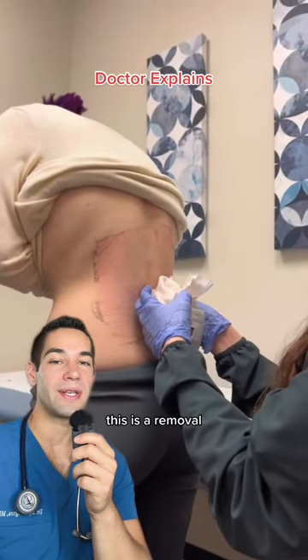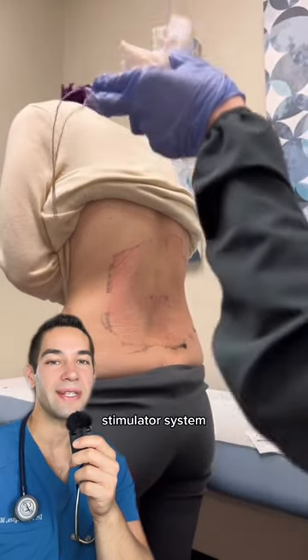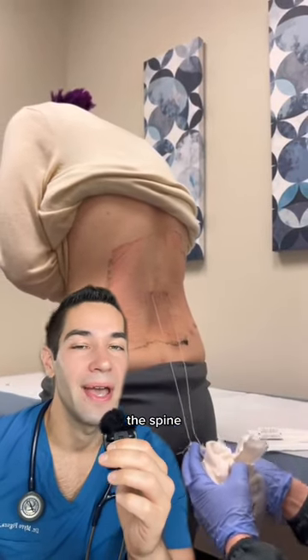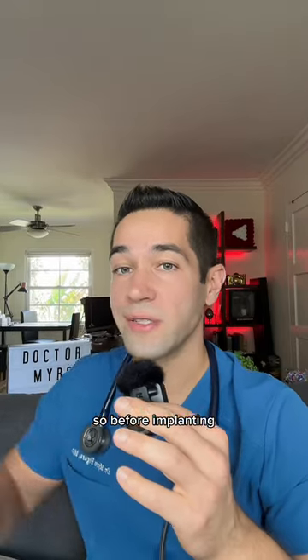This is a removal of temporary leads for a spinal cord stimulator system. This device sends electrical impulses directly into the spine and is used to control pain. Unfortunately, it doesn't work for everyone.